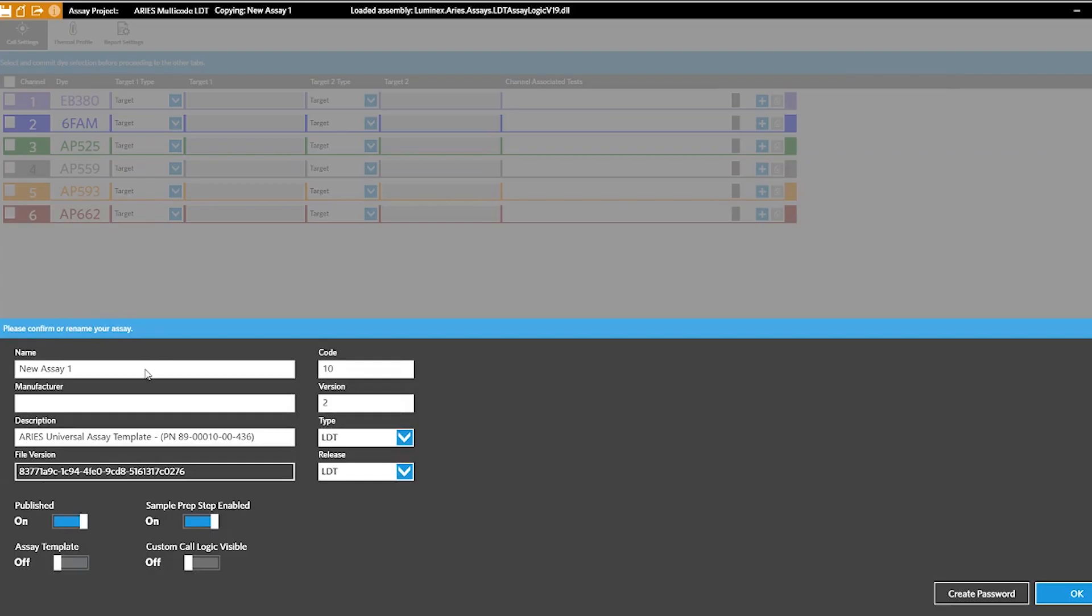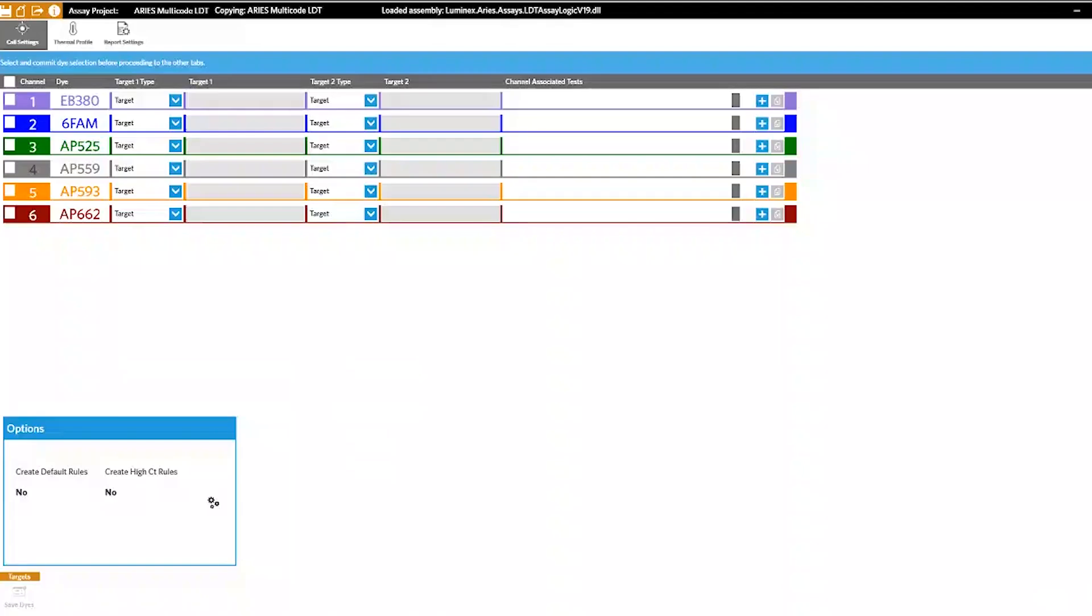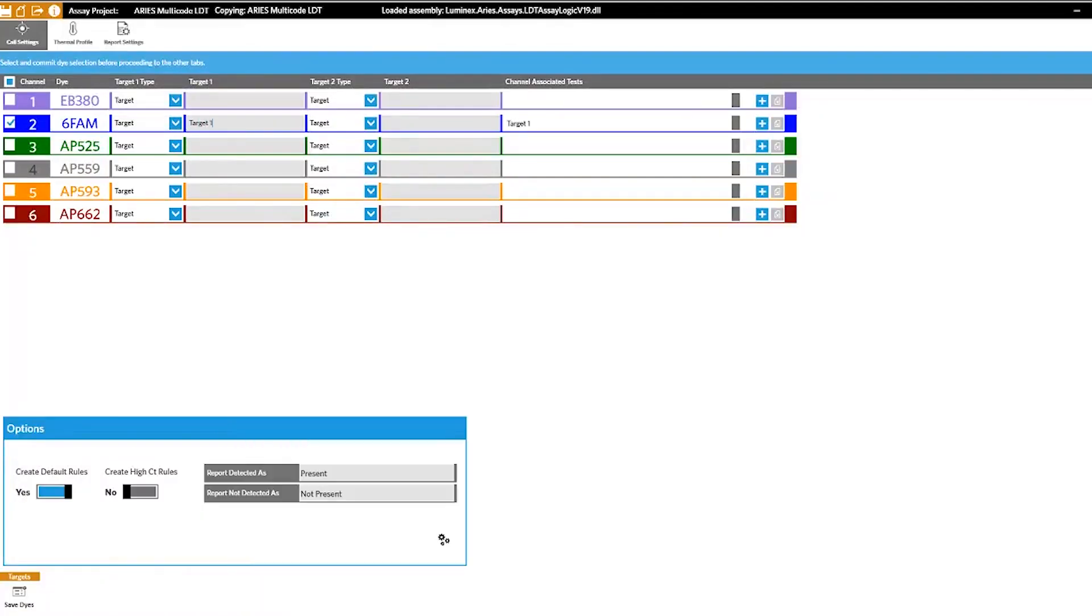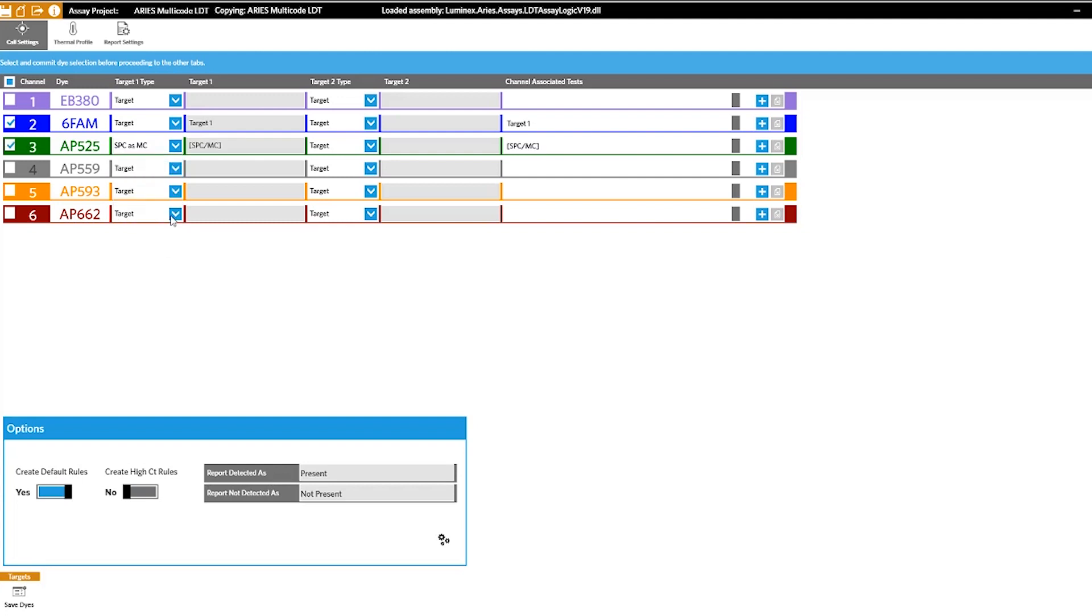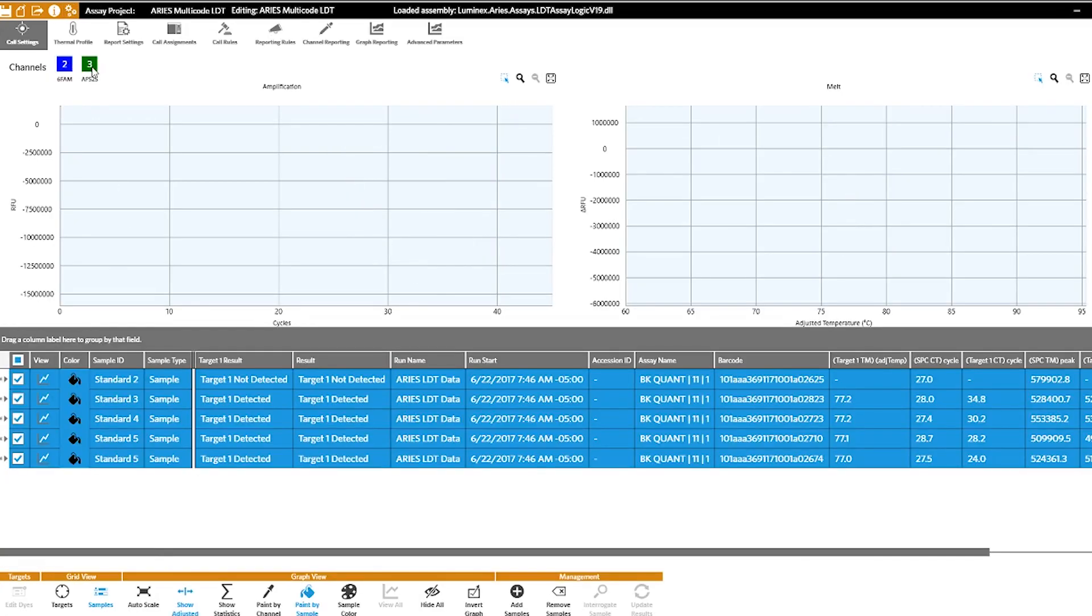When designing your LDT, start with the assay file in synced software and make the necessary modifications specific to your assay. These modifications can include selecting fluorophore channels, calling criteria, and thermocycling parameters.